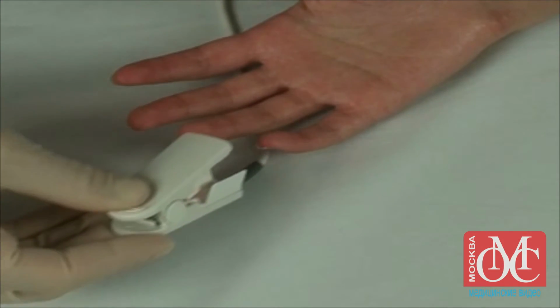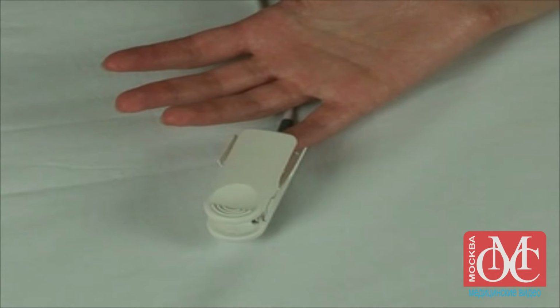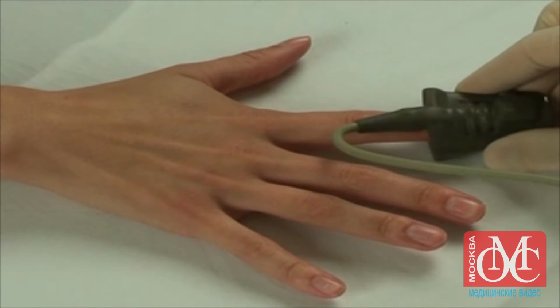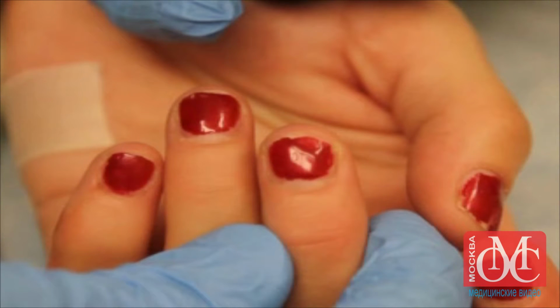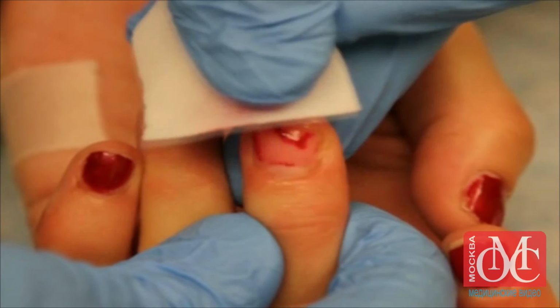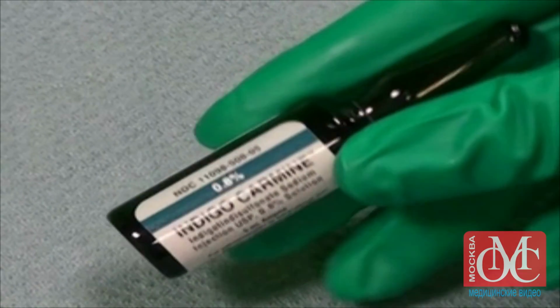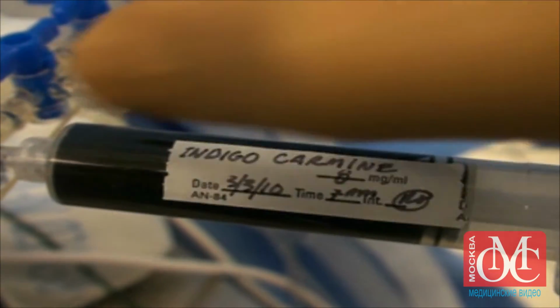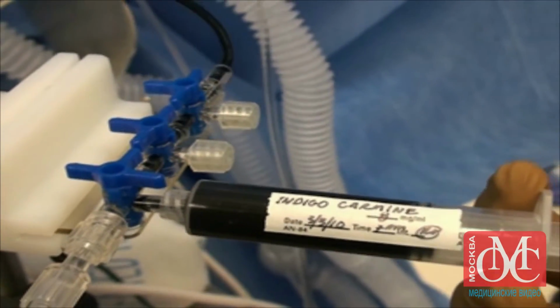If the probe is poorly placed or is the wrong size, light from only one light-emitting diode may pass through the tissues, or the light may not reach the detectors. This will result in falsely elevated or depressed results. Nail polish that absorbs light at 660 nanometers or 940 nanometers may also interfere with the pulse oximeter and result in an inaccurate reading. This problem can be avoided by removing the nail polish. The presence of intravascular dyes such as methylene blue or indigo carmine may alter the red and infrared light absorption properties of the blood and tissues, also resulting in an inaccurate reading.